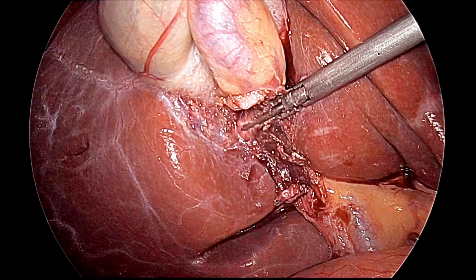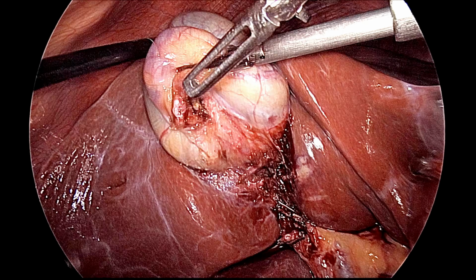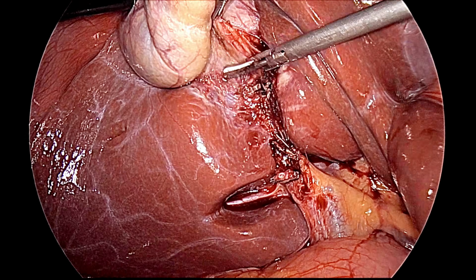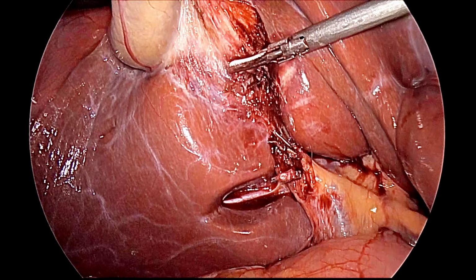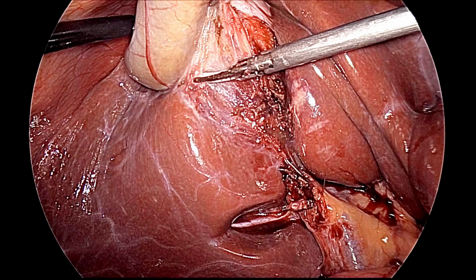Then now it is over. After that, we have to separate the gallbladder from the liver. So you should catch just below the clip so that the clip should not get disengaged, and slowly an areolar tissue plane should be achieved and the gallbladder will be separated from the liver.